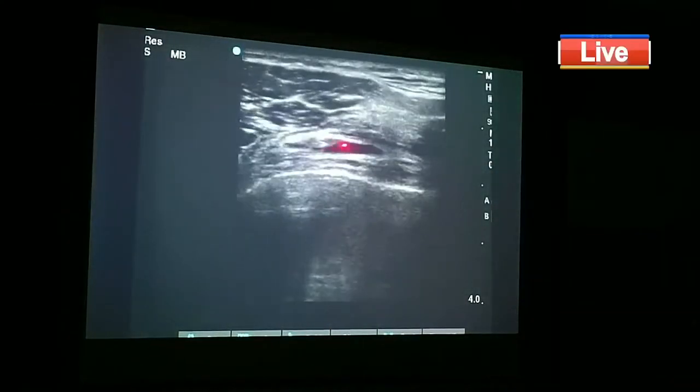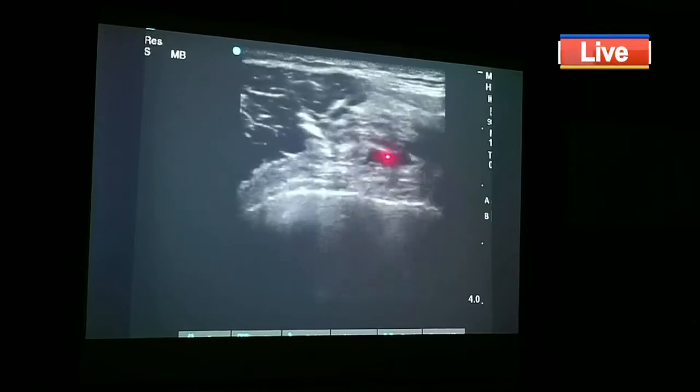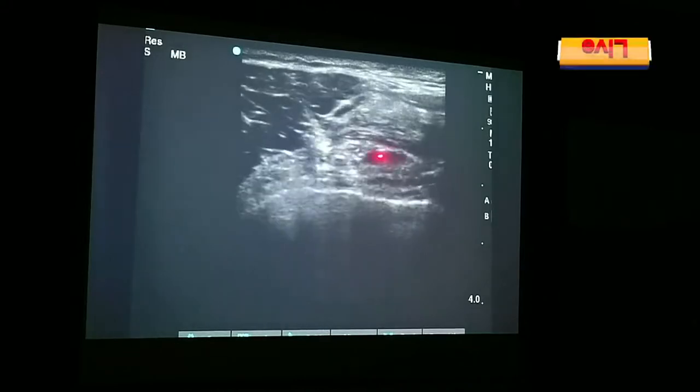Okay, can you see this little bit of fluid and sliding things on top and bottom? You can see the sliding things. I'm doing this maneuver, I'm just pressing and releasing. तो दर्द तो नहीं हुई ना? नहीं, बाद में बोला सर आपने बहुत दर्द की, है ना?